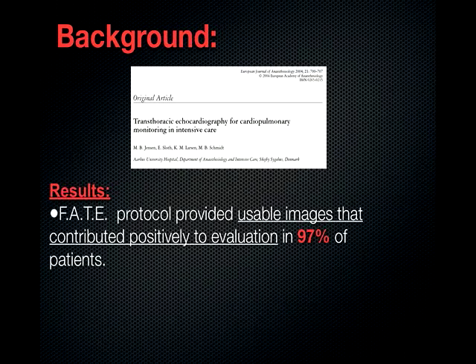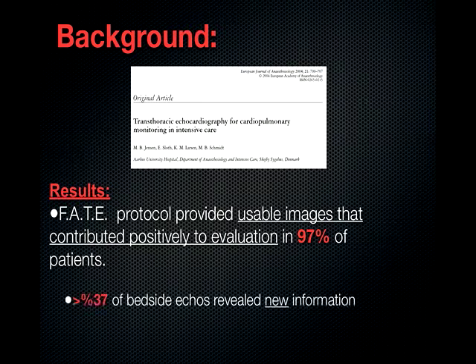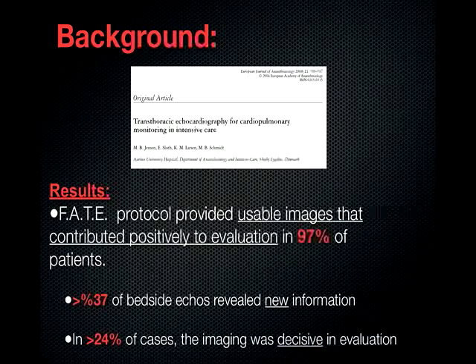And the results of this showed that the F.A.T.E protocol provided usable images that contributed positively to evaluation in 97% of patients. More than a third of bedside echoes revealed new information that was not suspected prior to approaching the patient. And in about a quarter of the cases, the imaging was decisive in evaluation. When you're at that fork in the road about what to do with the patient, these images helped decide which way to take the therapy.